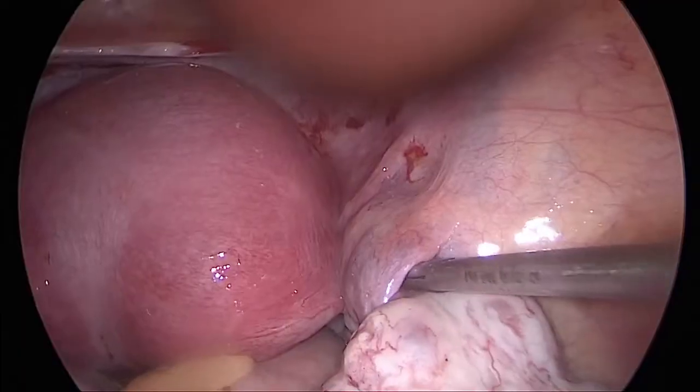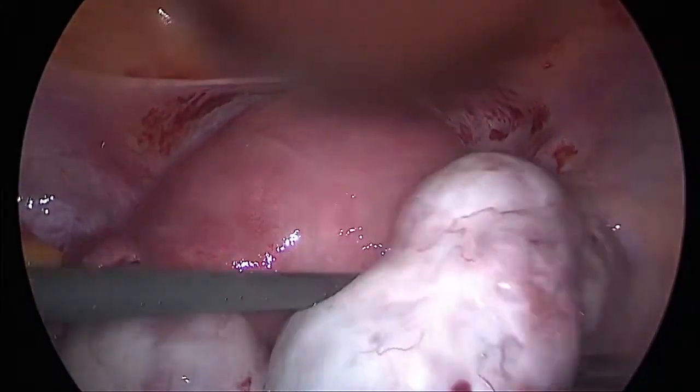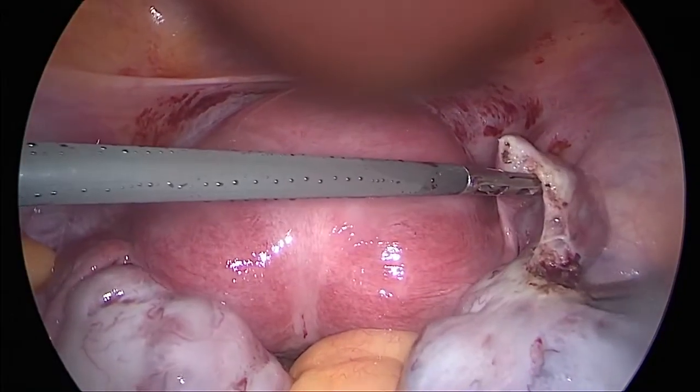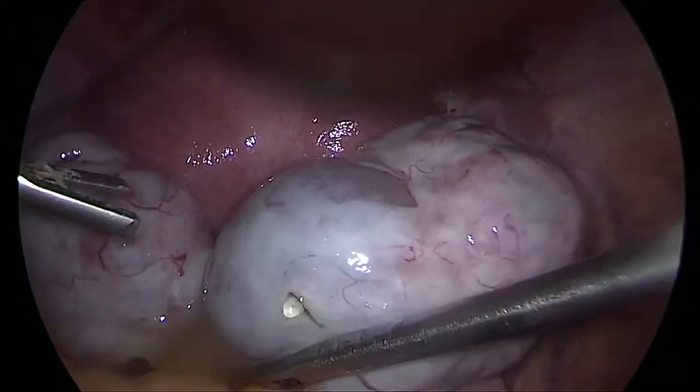The ovarian pedicle looked like it had undergone a degree of torsion. We untwisted the ovary, punctured the ovarian cyst, and completely drained its fluid.